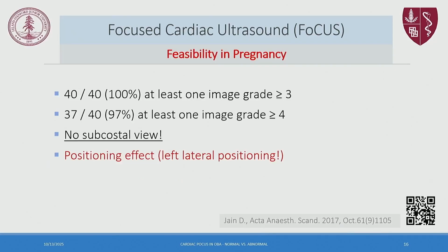And also here, this is a group from Denmark. They have shown that novices, after 1 day of a workshop and 20 to 30 supervised scans, were able to get, in more or less 100% of patients, at least one image with an image grading of 3. An image grading of 3 is an image quality that is sufficient for clinical decision making.